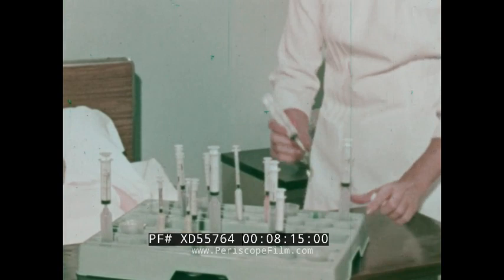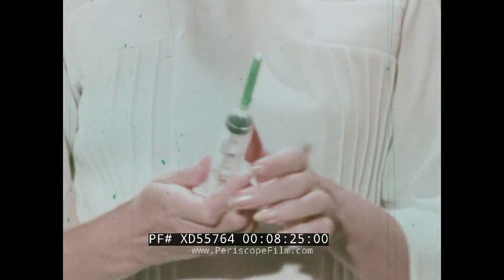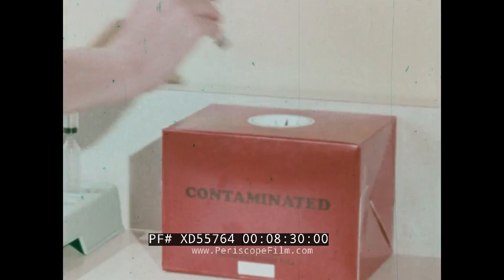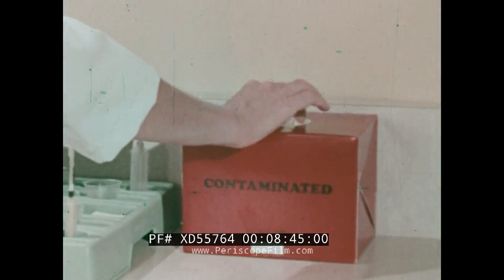For your safety, when the injection has been given and you do have a contaminated needle, there is no danger of accidental puncture when resheathing the needle. The needle point being encapsulated assures the complete environment of safety within the hospital. Housekeeping and other personnel are safe from accidental punctures. Now both needle and syringe are useless. For absolute safety, all parts are placed in the contaminated materials box for incineration or disposal, and the obligation to the area of society has now been fulfilled.